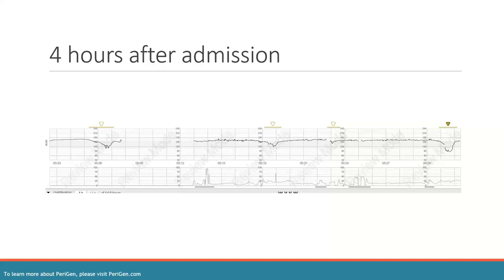Infant tachy, does mom have a temp? Question mark. Need to treat the temp. Fetal intolerance, tachycardia, minimal variability. What have we done for her? Fluids, oxygen, position change? Question mark. Tachycardia with decreased variability. Bolus, question mark, position change, question mark.